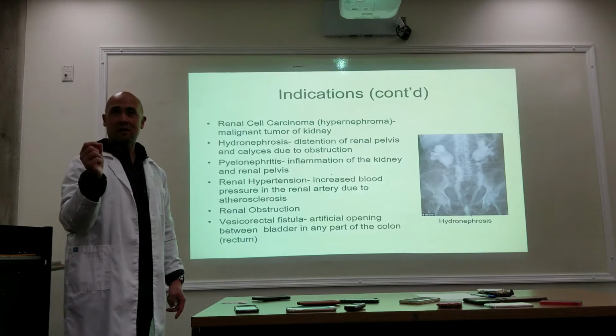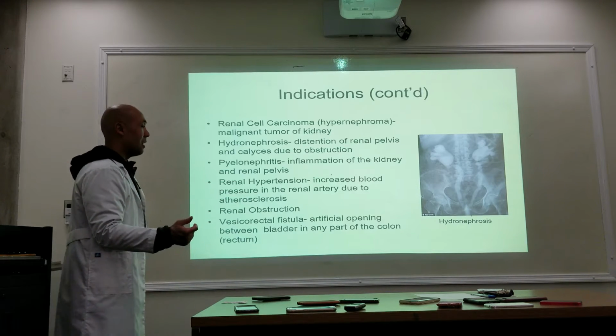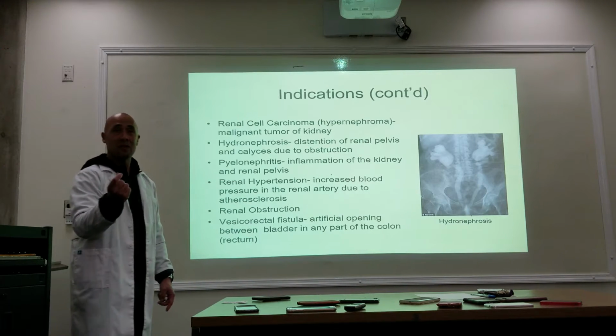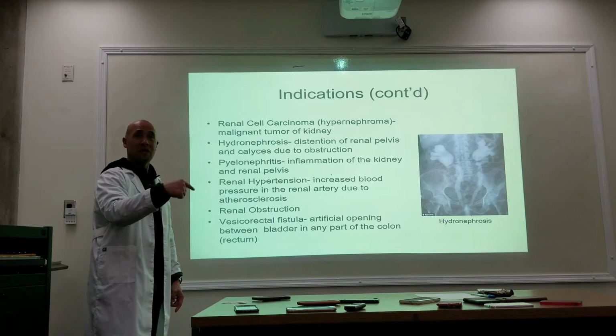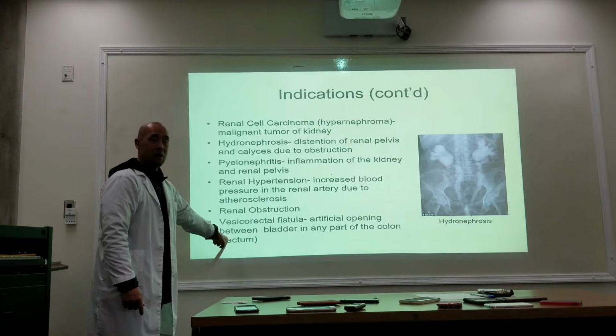Remember with the defecography? Okay, that is the GI portion of it, because we're also trying to analyze if there's a communication between the rectum and the vagina. This is another way to do it. Okay.